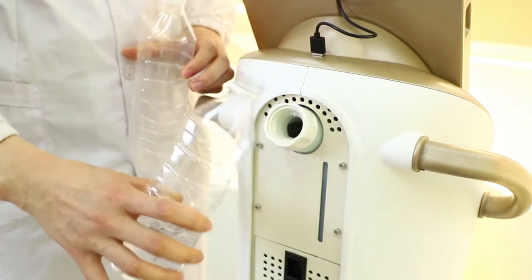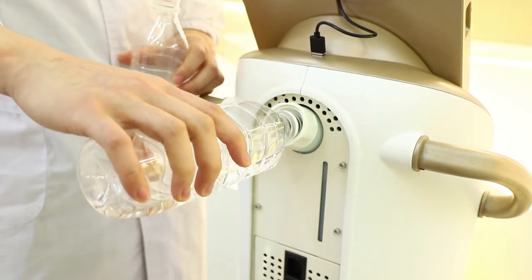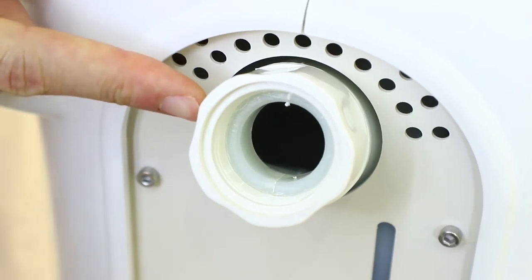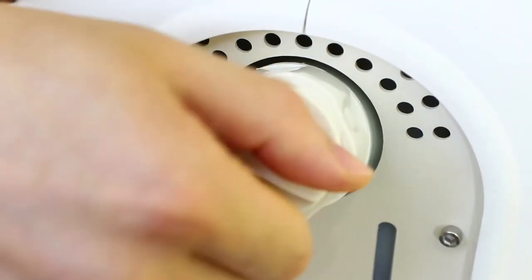We need to check if the water tank is full. As we can see, the water tank is full, so we can install the water tank cover.